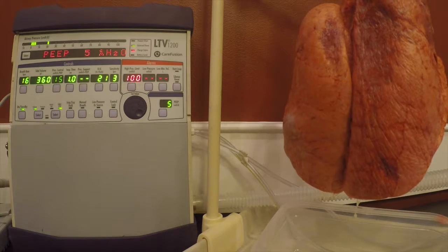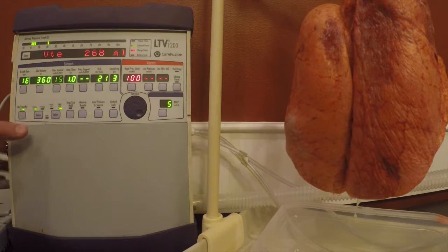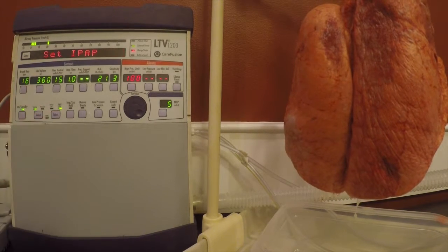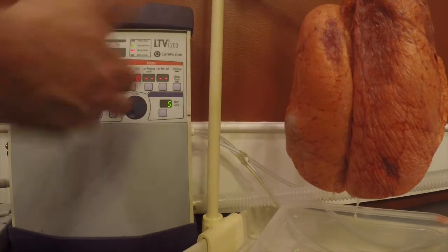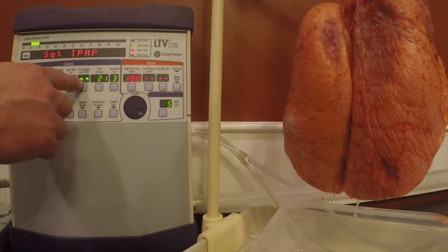The first thing we want to do is hit SINV, make sure we're in SINV. We want to hit select and have it blink, then hit select again. You can see that I've got the pressure support turned off, but if it wasn't turned off and it was sitting at 8, we would actually turn this to 0 and hit select.